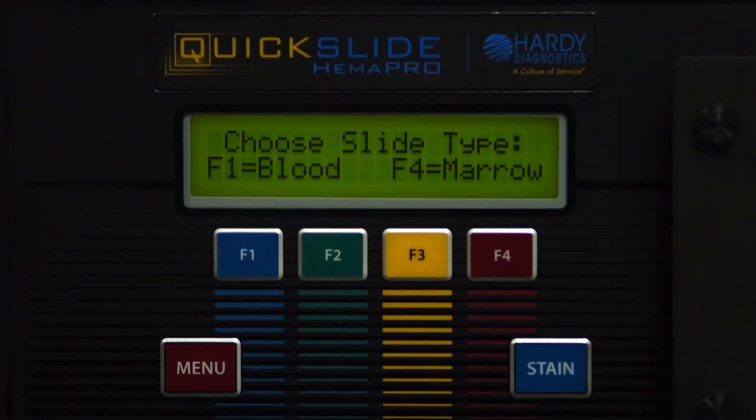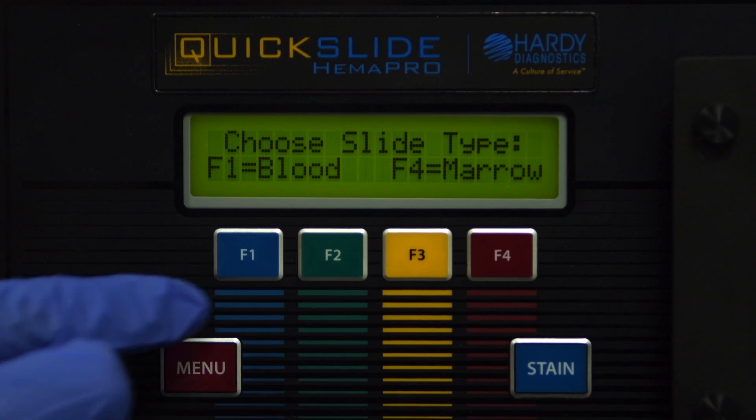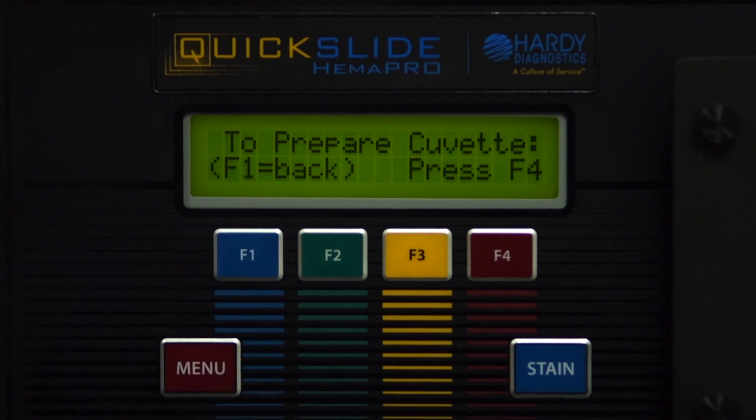Once priming has been completed, press F4 to continue. The display will read F1 for a blood smear and F4 for a bone marrow smear. Choose the stain procedure for your corresponding specimen.